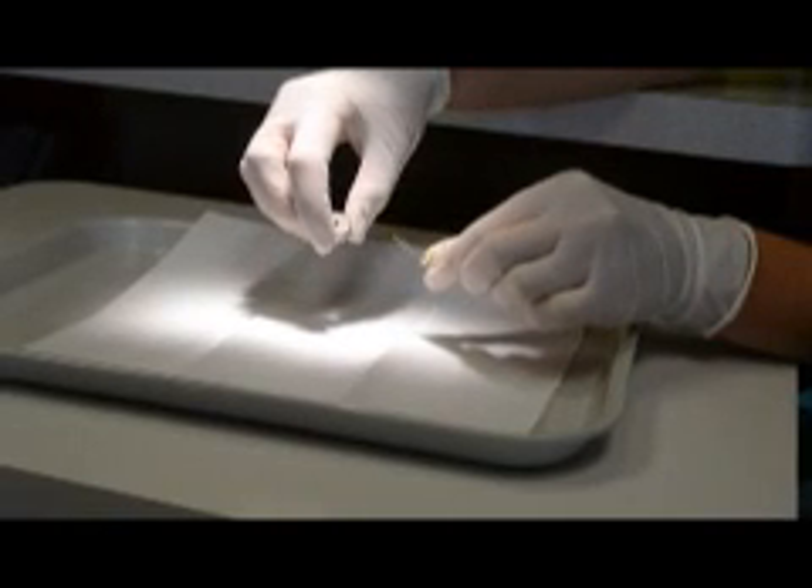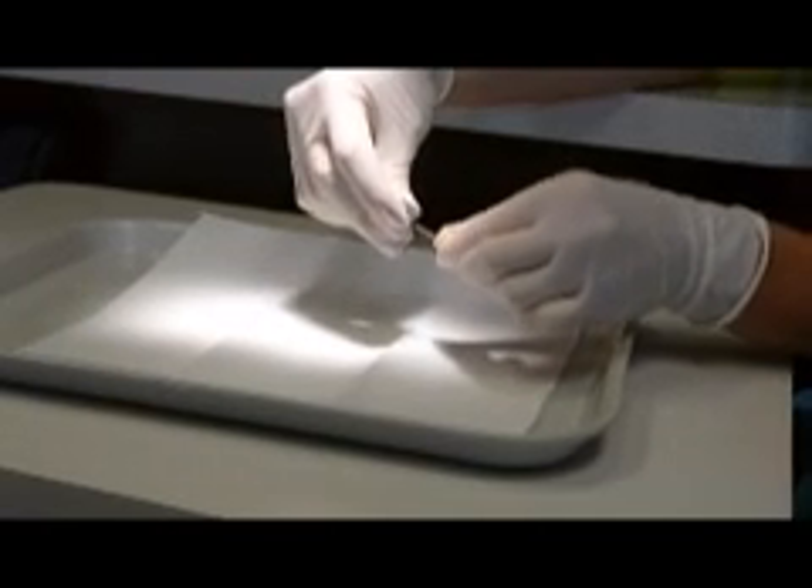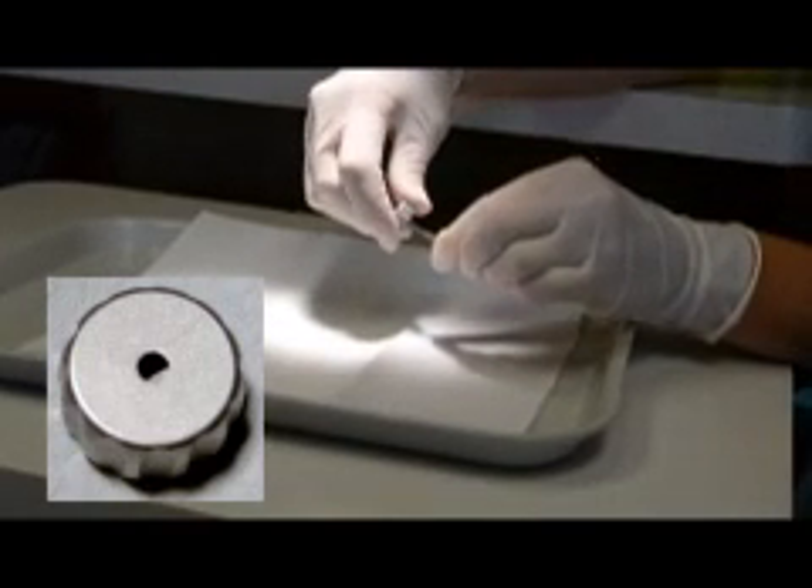Next, place the knob on the extractor with the round hole towards the extractor. Spin the knob slowly until it seats down onto the head of the extractor.